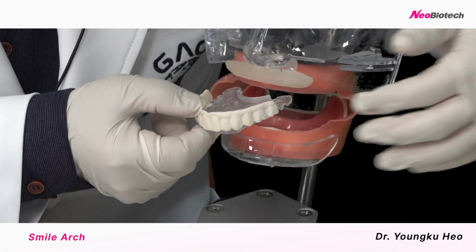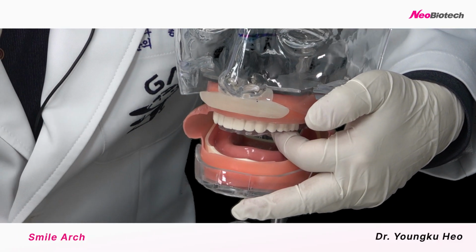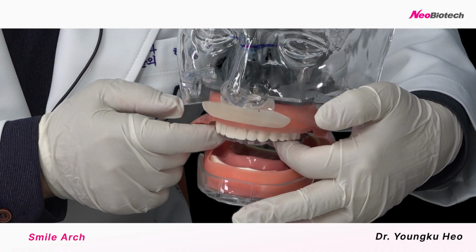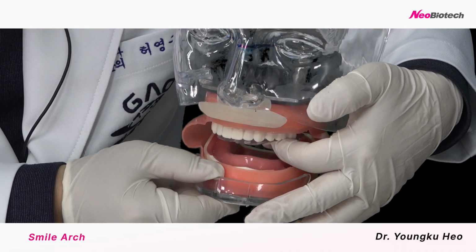After the impression, you can put it here. Okay, and the patient can see the mirror. You can check the smile, patient smile. Okay, and also we can make a CR record on top of it.